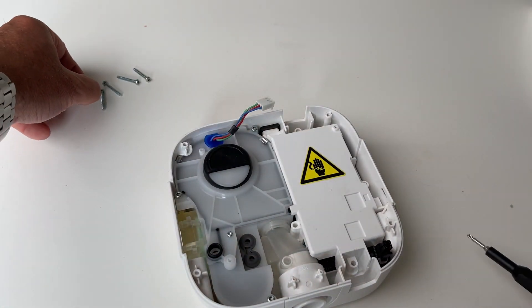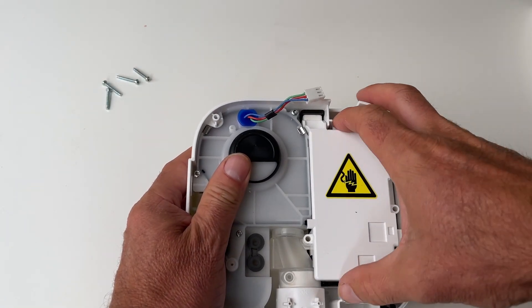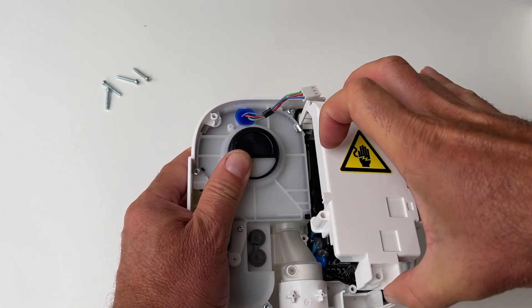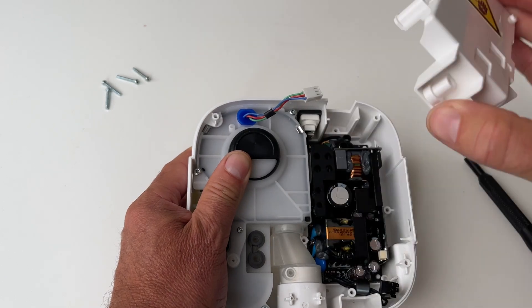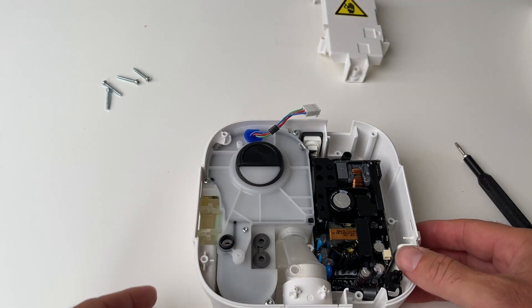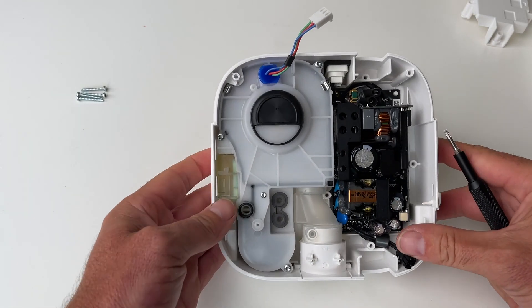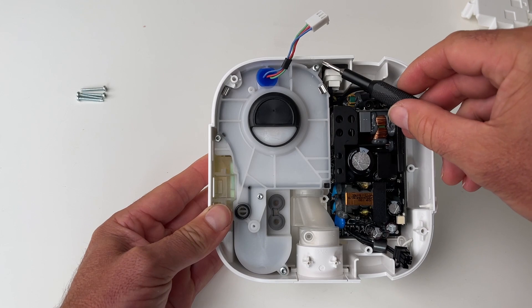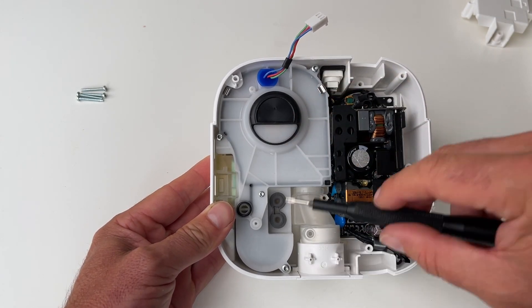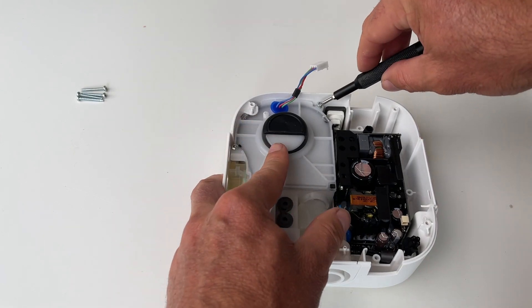We've got the four big screws out and now this top of the casing here should just come off pretty easy — it pulls off. Once we've got that out we can pull out this casing part. To take the turbine casing out we need to remove a few more screws — one, two, and three. These are quite long screws again.